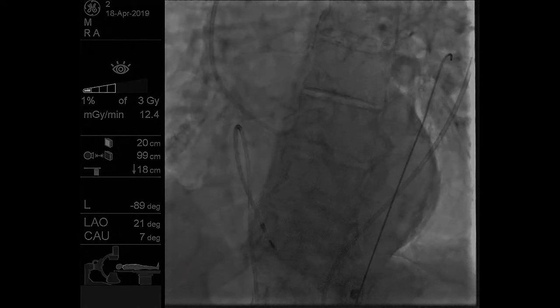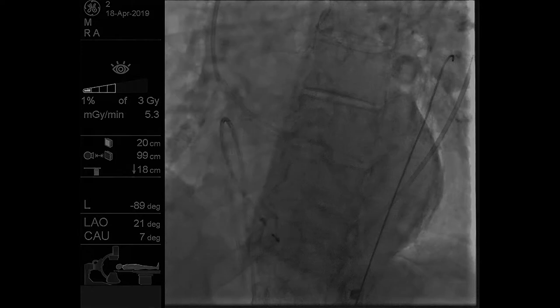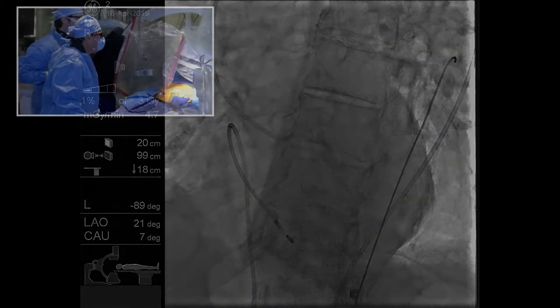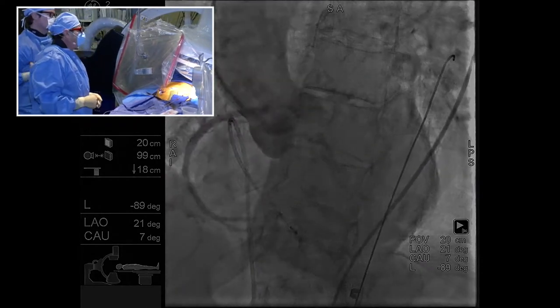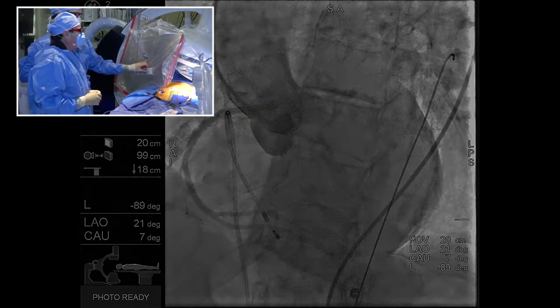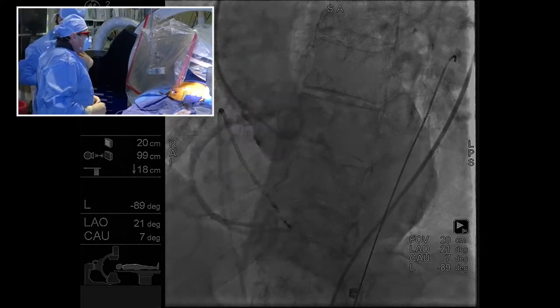All right, so you can see, how's the image, Jen, can you see this? Okay, good. I'm going to do an injection here. What we see is the CT wasn't bad, but you can see there are three sinuses, and the one that the pigtail is in is in the middle, and that is a little higher. So it's really not perfect. So you have to follow the middle one.